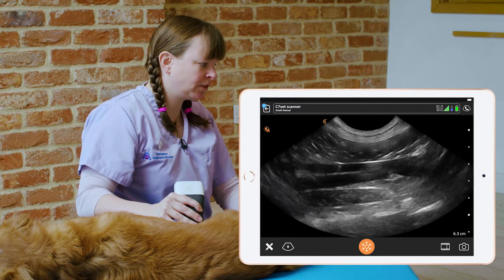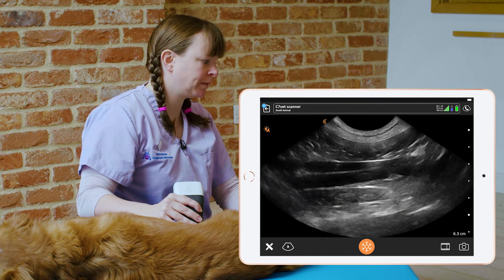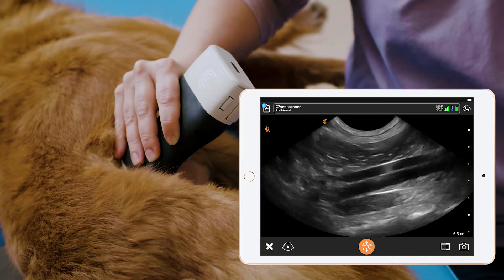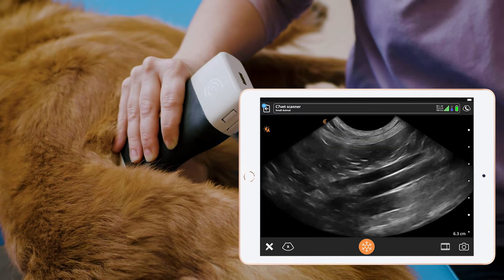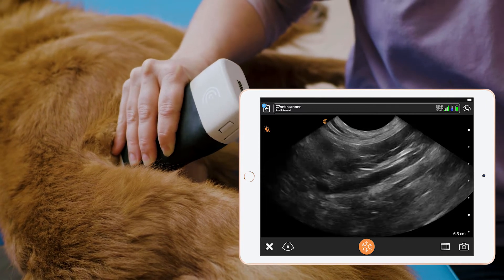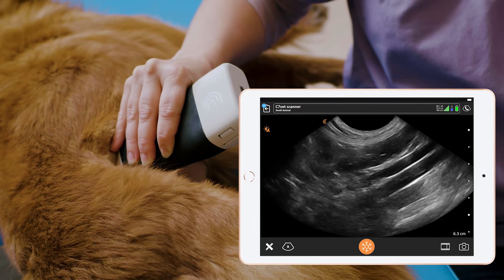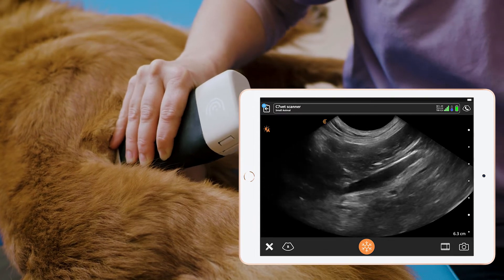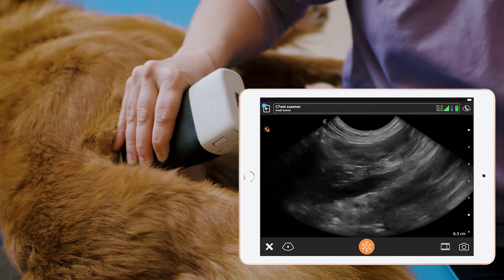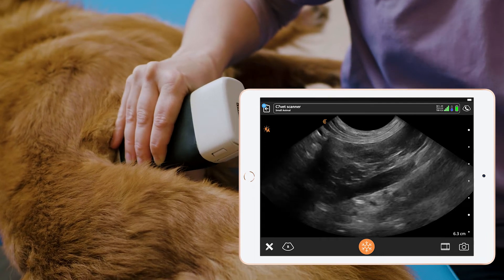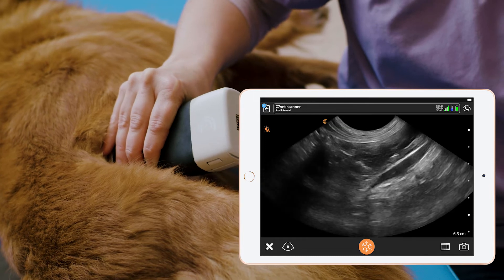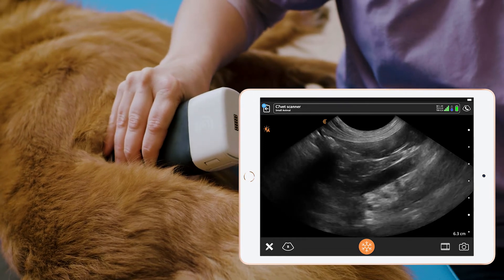Here in mid-abdomen they're very close to each other. As we move cranially we can see them start to diverge. There we can see the left renal artery leaving the aorta again. As these two blood vessels — the caudal vena cava and the aorta — diverge from each other, this is the area we want to fan in to try and find the right adrenal gland.